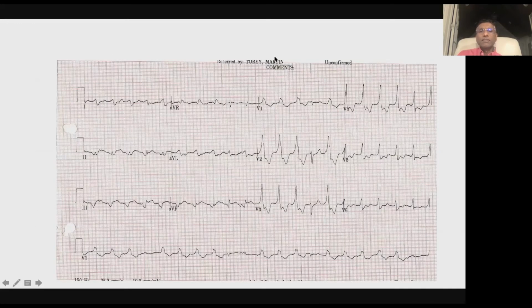Nice. Okay. One of my retired partners referred one of his patients. This is actually a nice patient, a 70-year-old woman who came in, who'd had chest pain about 10 days ago and comes into the ER. She was just sitting there talking to us, and this was the EKG.